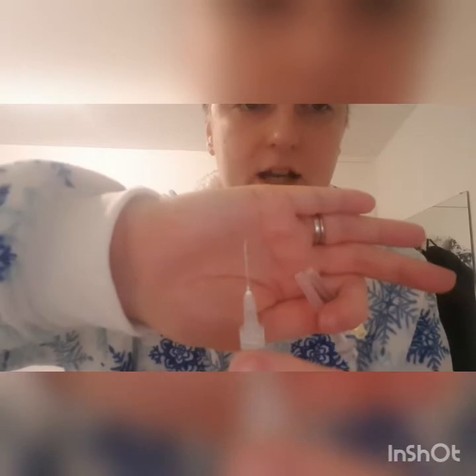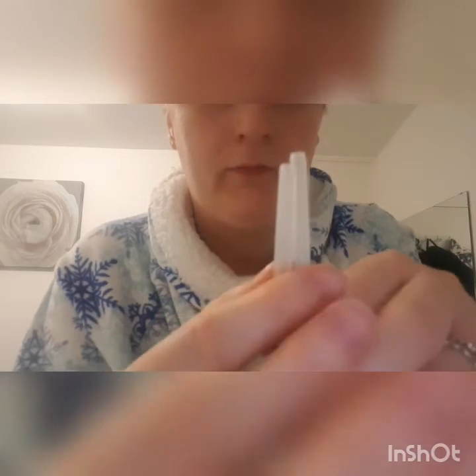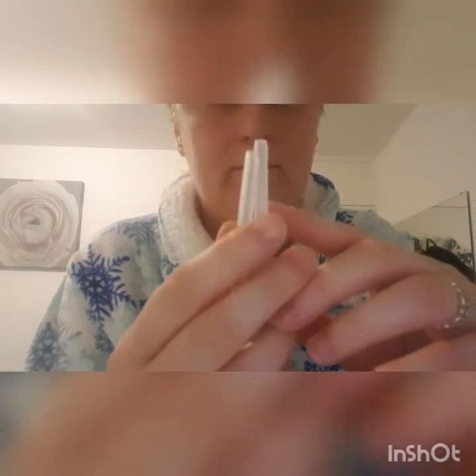As I said before, I am going to show you the difference between the needles. So that is the one I've just injected with. Oh, it's not going to come off. I think I've locked it. Normally they would come off because I normally pull them off. No, it's not working, guys. It's typical. I don't know if you can see, but the yellow one goes to the top of the cap. The grey one goes to there. So that one's there, that one is there. So that's it, guys. That's how to do Cetrotide.